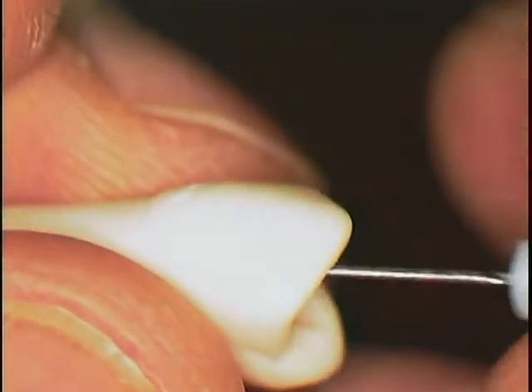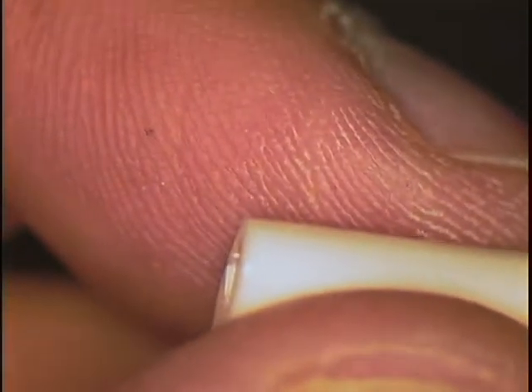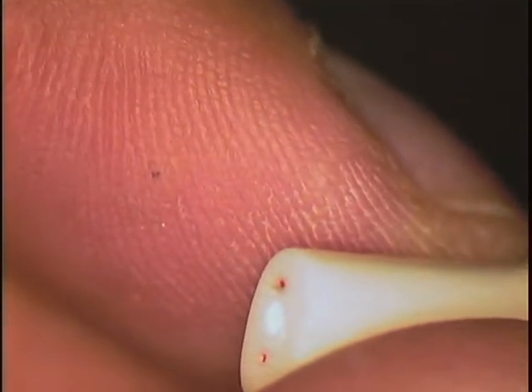Otherwise, you're going to hurt the tooth, and you're going to cause a blockage, and the infection is not going to clear up. It's okay, so that's 19 and a half. I go right back in place. And you can see, you know, obviously my apical constriction is a little more open than I thought. See, now my 20 is passing through there too.